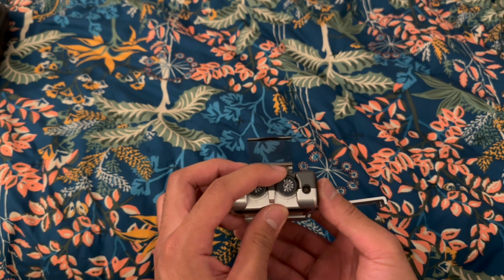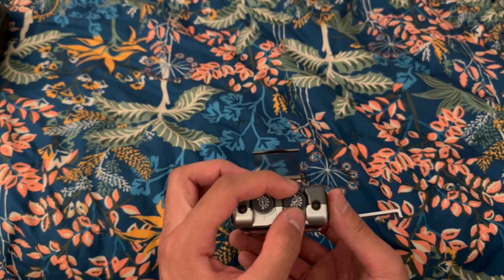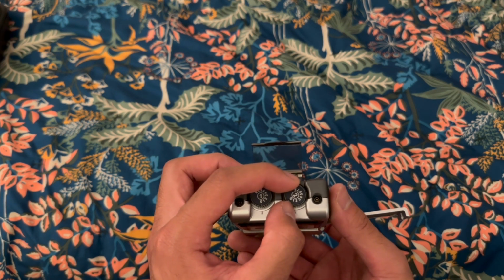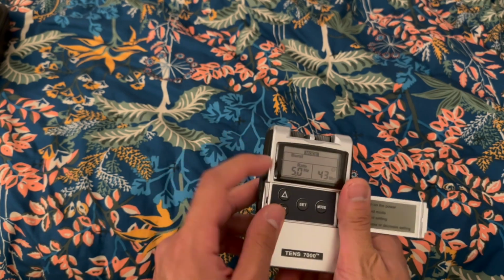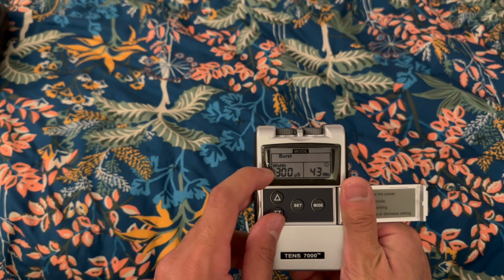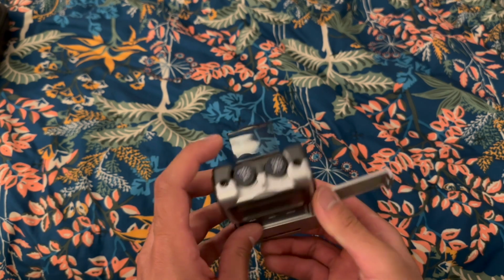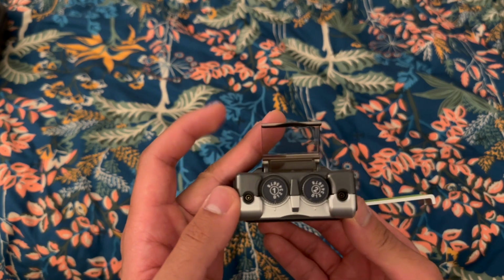Depending on the parameters that they have for their choosing, they can adjust this to have more of a motor twitch response, or a different response for just tingling. Obviously, that will also be dependent on the rate and the width that they decide. But this is for their comfort and feeling of the stimulus.